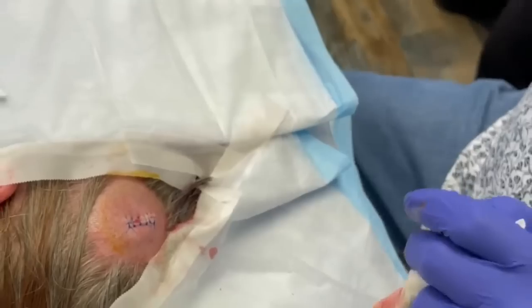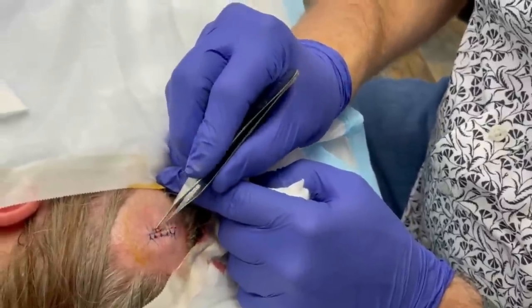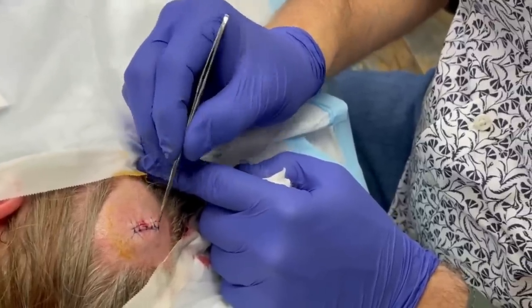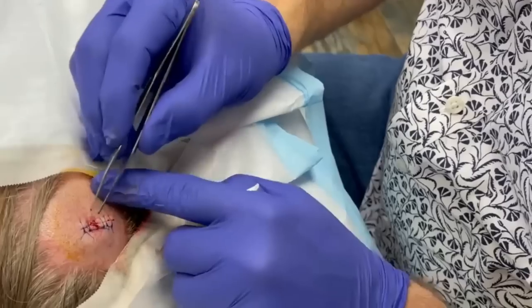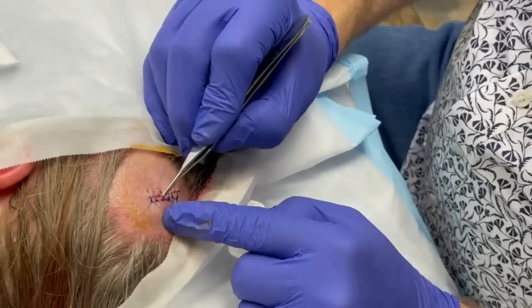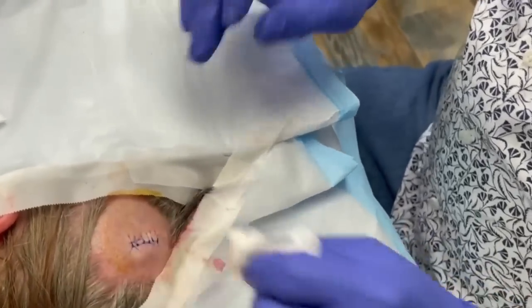Can I get a little forceps real quick? Right there. Thank you. So I see just a little, see that right there, Jenny? It just looked like a little fibrous, scarry tissue. Uh-oh. We're not supposed to say uh-oh, are we? Okay, you did not hear that. All right, cotton-tipped applicator now, please. I got it. There we are. Okay, looking good, Jenny?